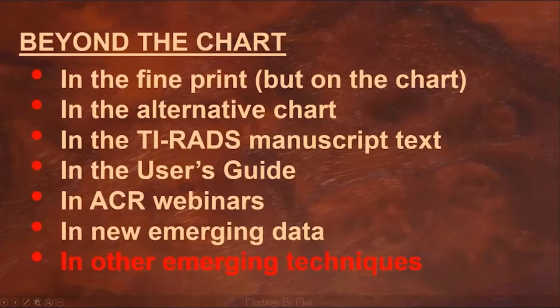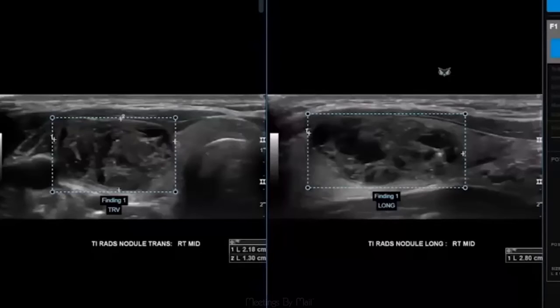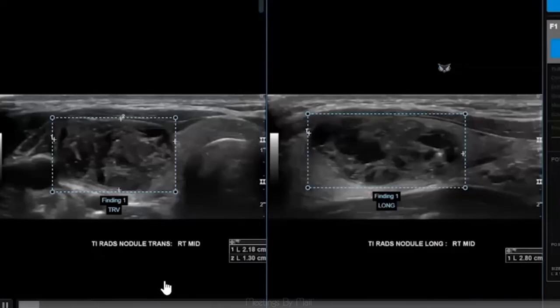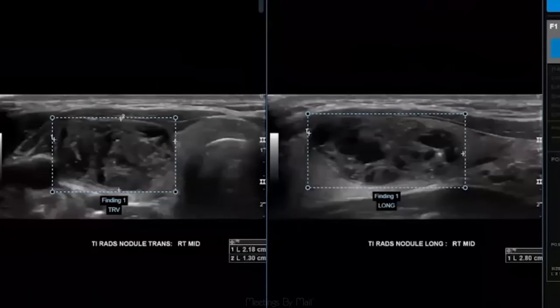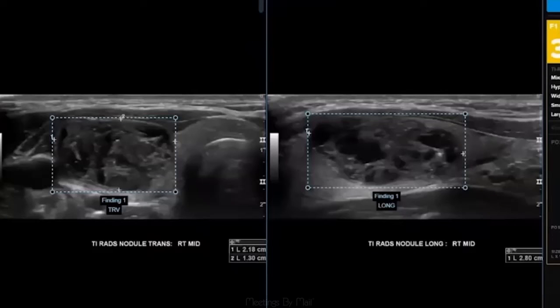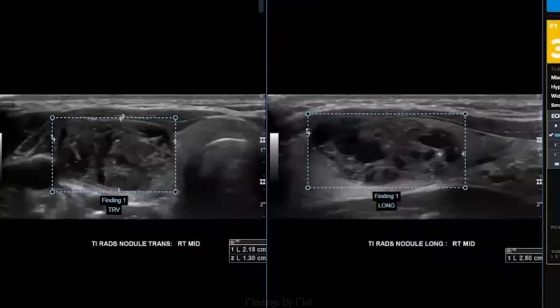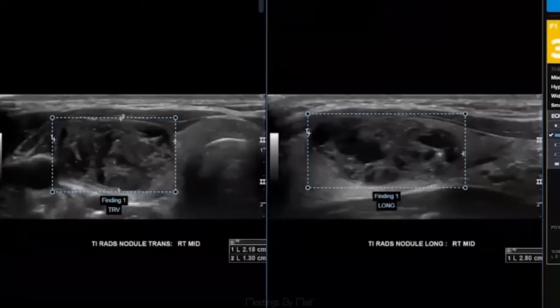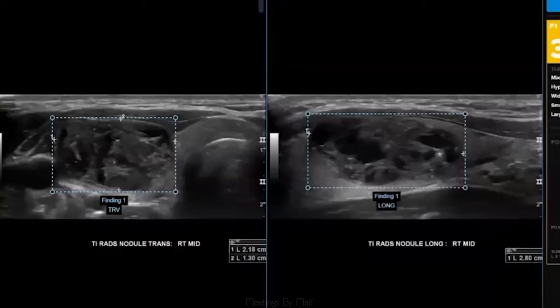There are some other emerging techniques being explored, and one that I think is particularly exciting is artificial intelligence. Here's a platform that's been developed — this is an example of a thyroid nodule with the regions of interest shown. I hit analyze for the algorithm to start its calculations. It shows the five different TI-RADS features: composition is mixed solid and cystic, echogenicity hypoechoic, shape taller than wide, margin smooth, and large comet tail artifacts. I'm going to check the confidence that the algorithm had — it's fairly confident, so I'm going to leave that alone.